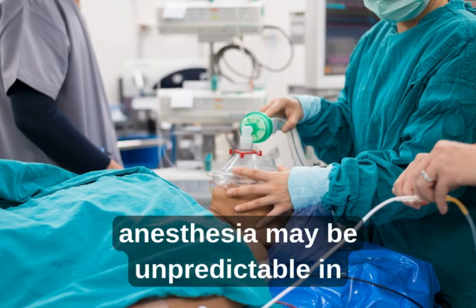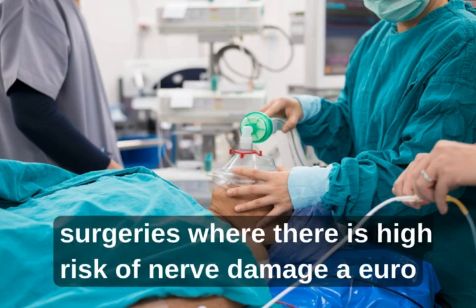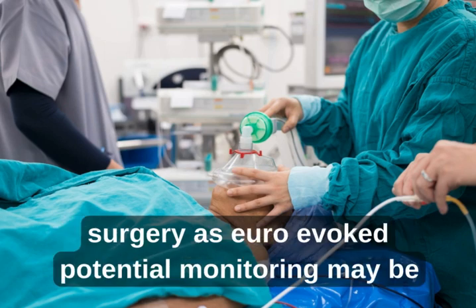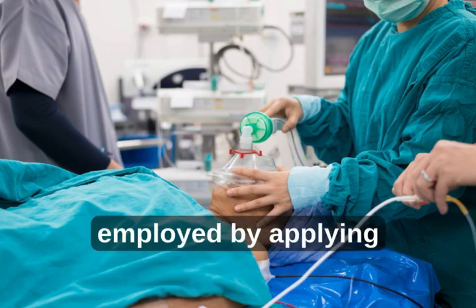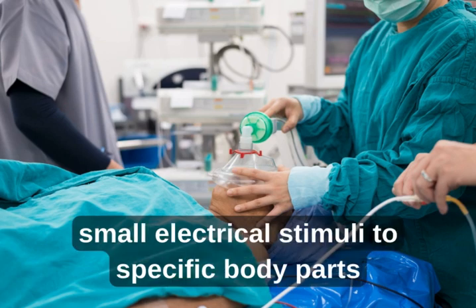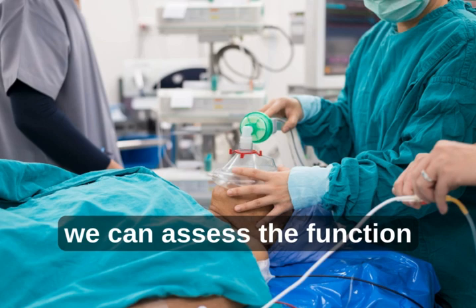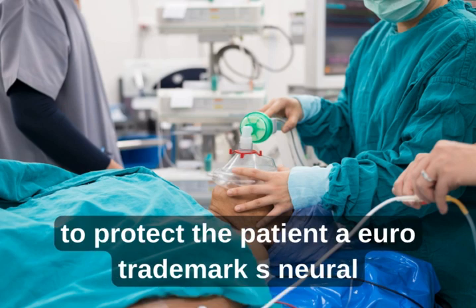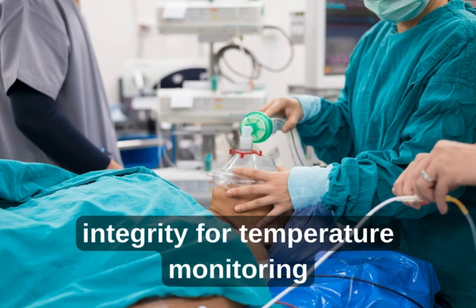may be unpredictable. In surgeries where there is a higher risk of nerve damage, such as spinal surgeries or brain surgery, evoked potential monitoring may be employed. By applying small electrical stimuli to specific body parts, we can assess the function of the nervous system and make adjustments to anesthesia to protect the patient's neural integrity.